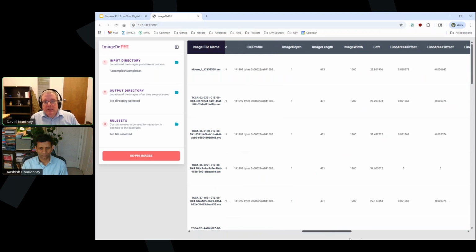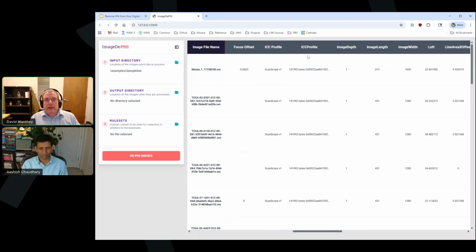And there's some things that we really want to keep that are long and complicated. Like, for instance, there's something called an ICC color profile. This is when you make a scan, the scanner should be color calibrated so that when you view it on your monitor, which is also color calibrated, it looks correct. Hopefully your software deals with all of that correctly. I've got a standard monitor in front of me that uses the sRGB color space, and so when I look at images, they're rendered in the sRGB color space. But I could have a P3 monitor or whatever, and this ICC color profile is vital to rendering that image correctly on whatever your monitor is.